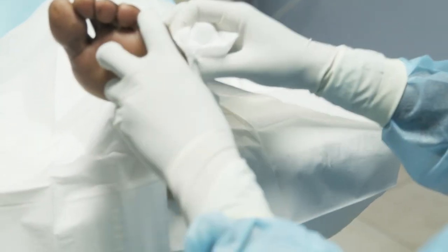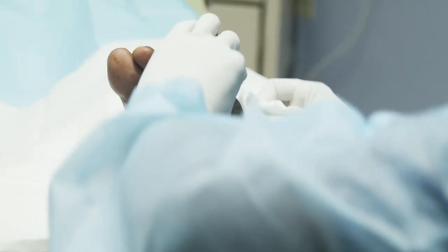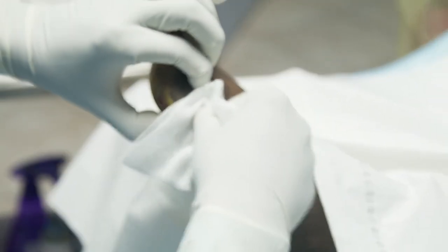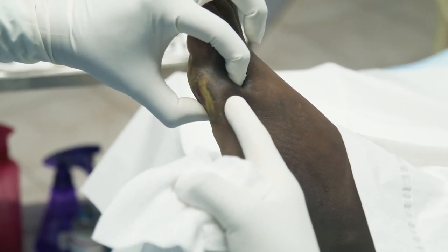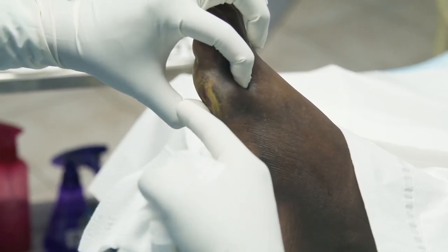Okay, so that's the angle we're coming at. For the next one, I do have a headpiece with a light on it. Maybe I'll wear that and I'll try that for Mr. Smith. So that's our angle. Boom, we're going in the bone. I'm gonna slide the bone up. So the bone is what's penetrating through this wound.